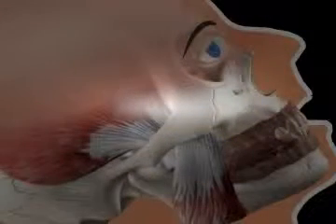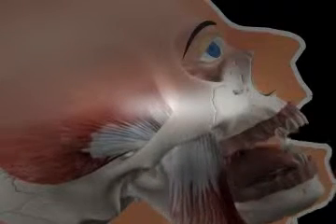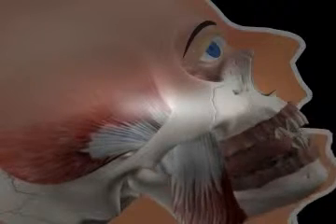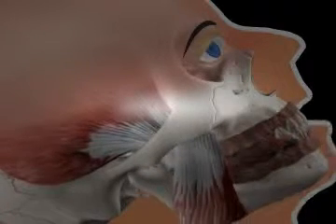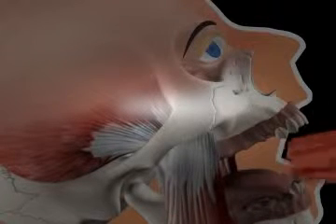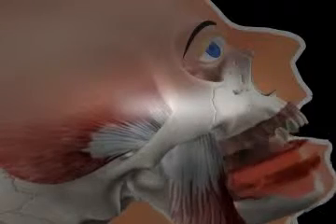As soon as the dentist receives the Bite templates from the technician, the patient visits the dentist a second time so that his bite can be taken. The dentist places the Bite template in the patient's mouth. Bite templates can be produced for both lower and upper jaws, depending on the remaining teeth. The patient bites carefully, thus creating impressions in the wax wall of the Bite template.